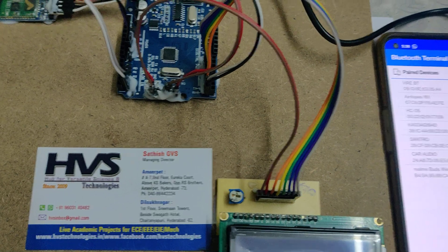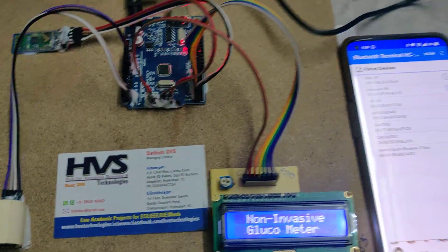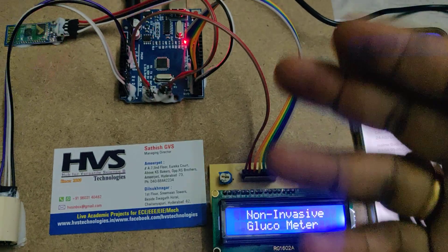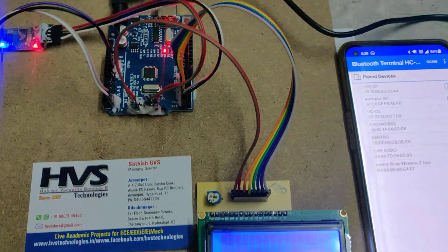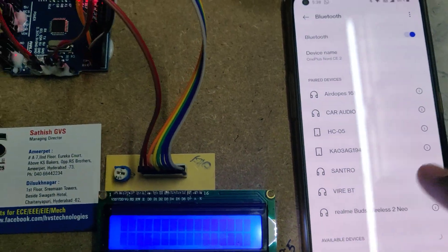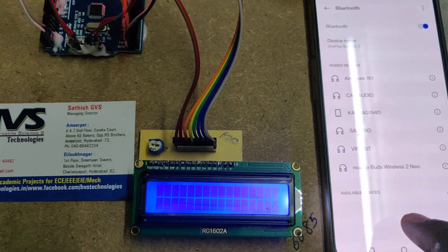After that, turn on the power supply. We are using an adapter that accepts 100 to 250 volts AC — you can use your country's adapter which provides 12 volts DC input. Initially the LED will blink very fast, and you need to pair your mobile phone to the HC-05.